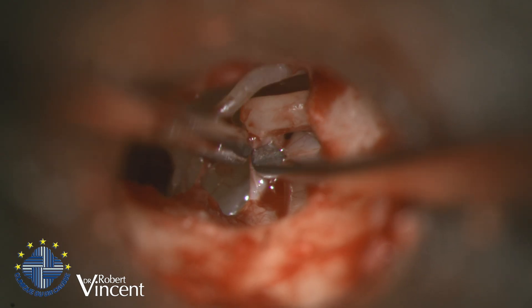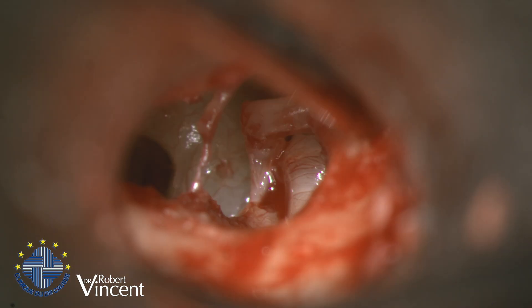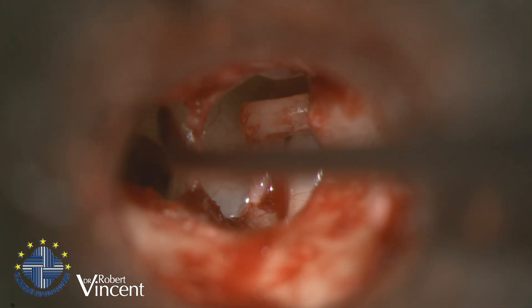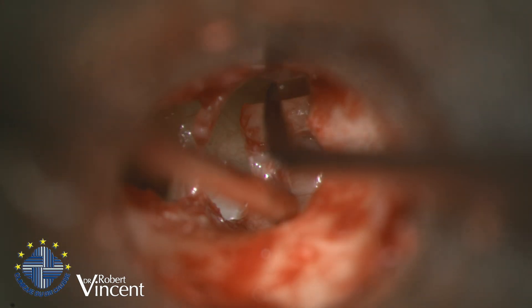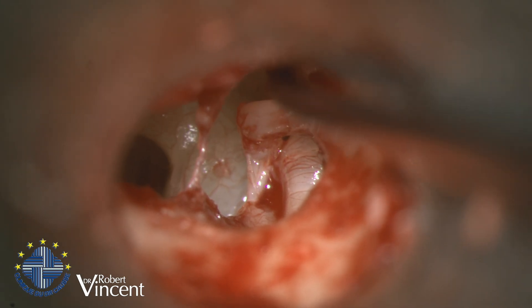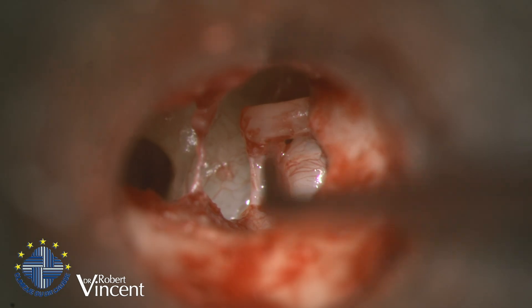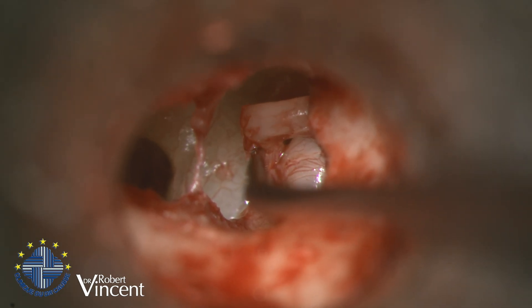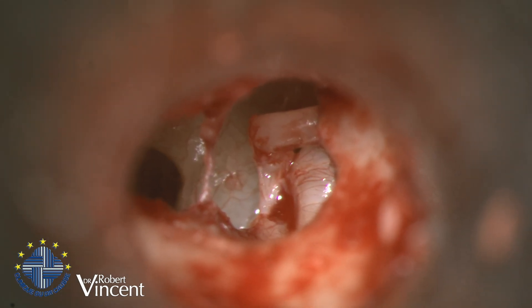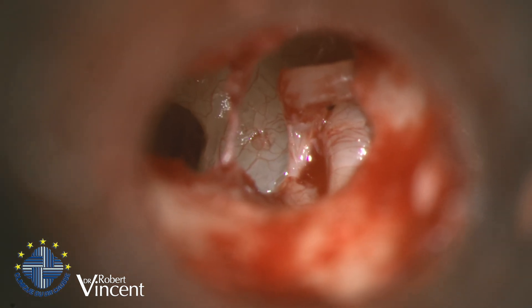I'm now using the joint knife. Note the chorda tympani is overstretched, but it was really difficult to make a nice approach. I'm going to check malleus-incus mobility — there's a slight decrease but I think it's fine. The stapes is completely fixed. The next step is to remove the stapes superstructure.